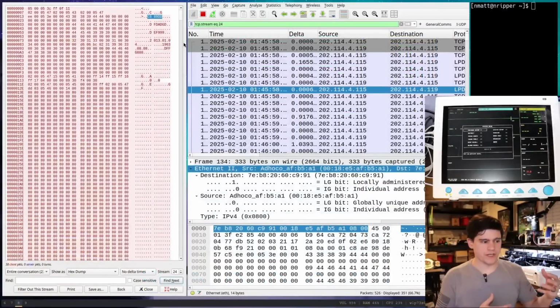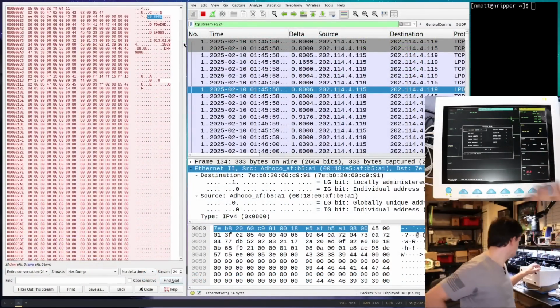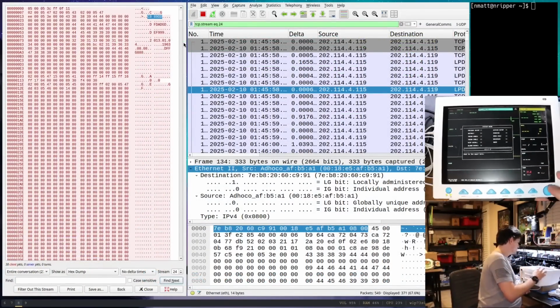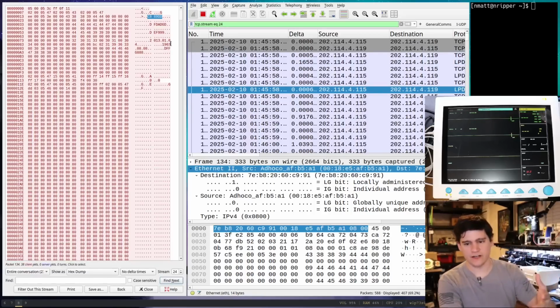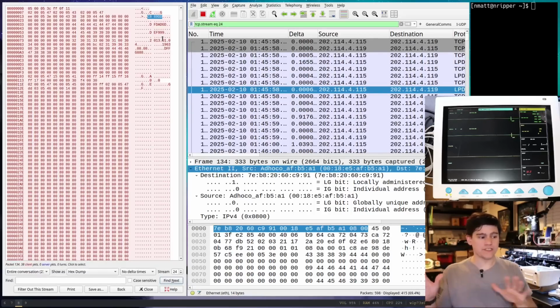So it's pretty clear that that data is getting... exit out of the other menu. There we go. So it's very clear from the get-go that this patient data is getting sent in the clear. And that's what they talked about in both those articles.